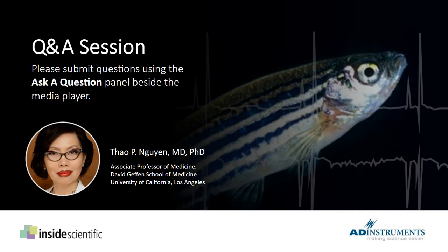So that is really, really a great question. Zebrafish P wave is the second largest component. The T wave of zebrafish is unfortunately tiny, and sometimes it is so small it's hard to actually diagnose or recognize on ECG. Not a problem with humans, right? T wave is the second largest component of the three ECG components for human ECG. Yeah, so that is a key anatomical difference. It can be to our benefit if we want to study, let's say, atrial arrhythmias in zebrafish.